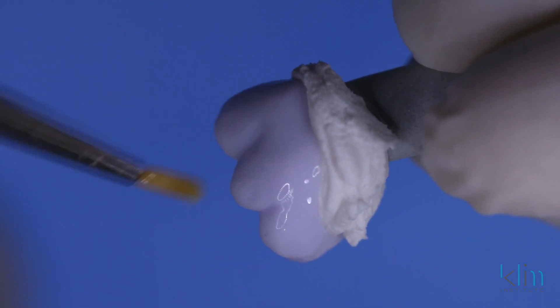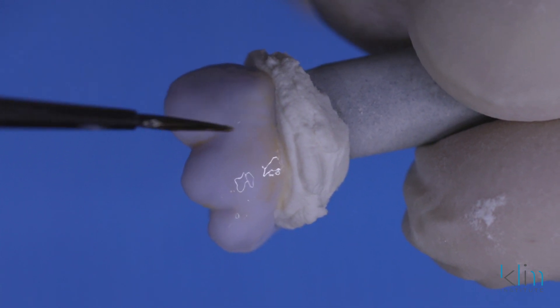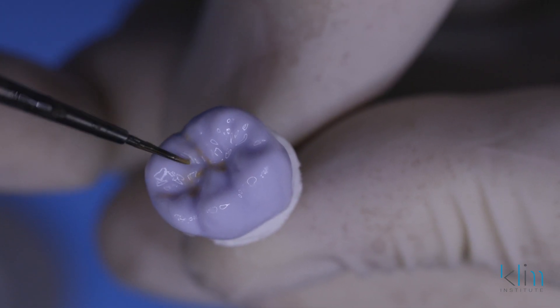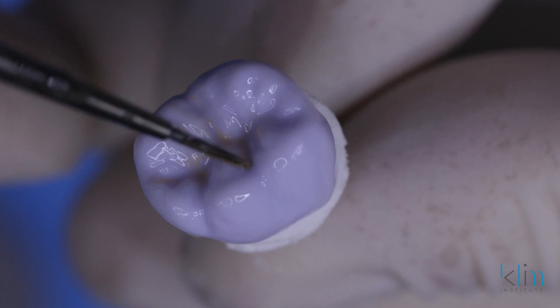Once the glaze is fully applied to that ceramic surface, we can do some color additions. My goal for color additions is to add some warmth to the cervical area on the buccal — that's usually A2 in most circumstances. On the occlusal surface, use your own imagination. I usually don't place colors on areas that are going to have occlusal wear because it's going to be gone in a short period of time. I want those cusp tips and those occlusal marks to be really polished well. So when we do add occlusal colors, it's mainly in the depths of the grooves.